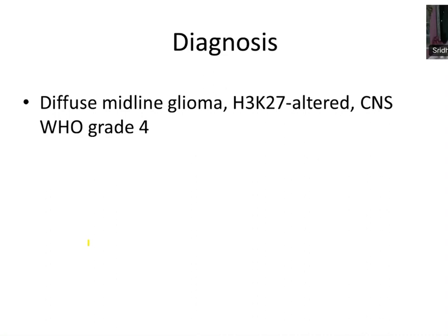Here, unlike the rest, in the first case you saw IDH1 R132H mutant-specific antibody IHC for IDH mutation. Here you saw H3K27M mutant-specific IHC for H3K27M mutant midline glioma. Okay. So this is also an IHC utility. You can pick it up.